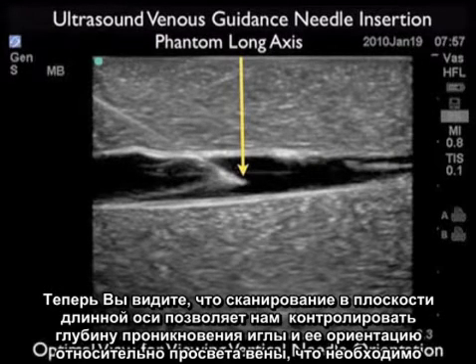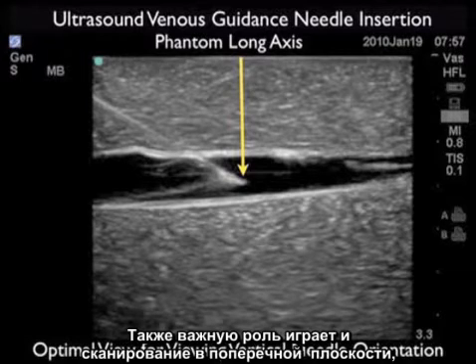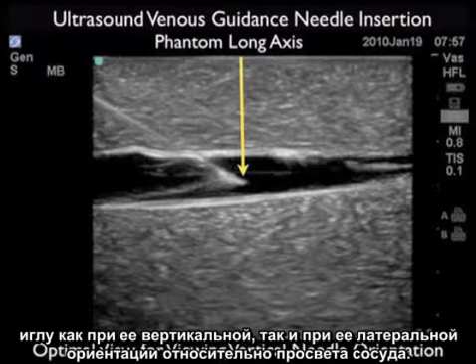Here we can see how the long axis orientation allows us to plan the optimal depth for the needle tip with regard to the venous lumen to squarely secure a cannulation attempt. This is in contrast to the short axis orientation, which was better for lateral needle orientation with regard to the vessel lumen. Using a combination of short and long axis orientations will allow you to see both lateral and vertical needle orientations with regard to the vessel lumen.